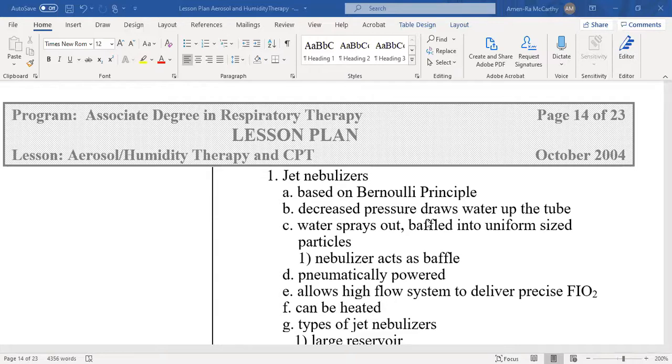Microns, we're talking about microns in size, all right? You want to learn that there's a therapeutic range for particles. What range do I want them particles to be in to give me the best penetration and the furthest deposition? Isn't that 1 to 3 microns? 1 to 3 microns, yes, sir. 1 to 3 microns is the therapeutic range, but I don't think we got to that yet, but that's good. That is it. 1 to 3 microns is the therapeutic size for aerosol particles.